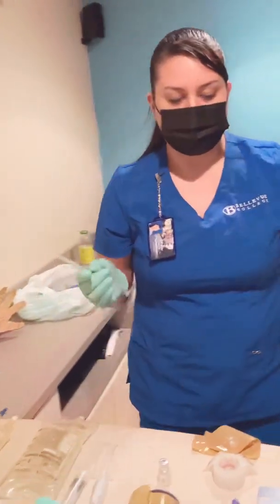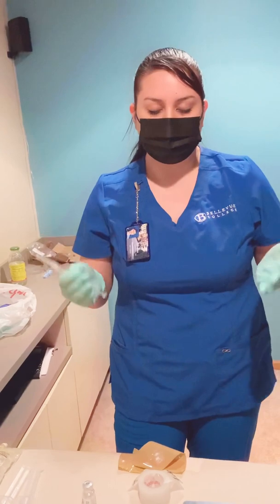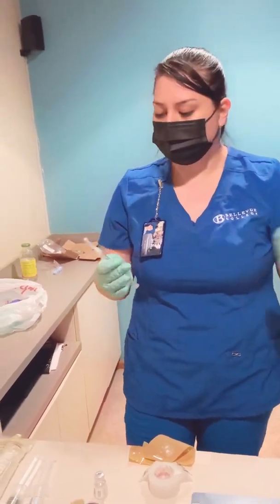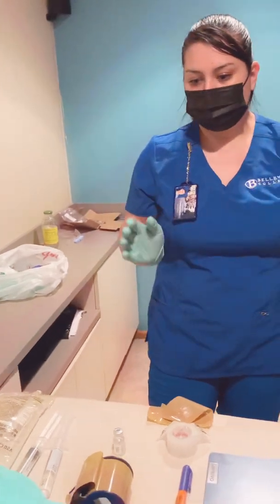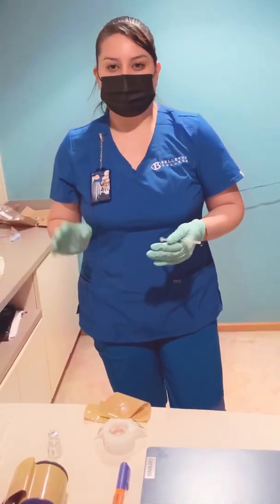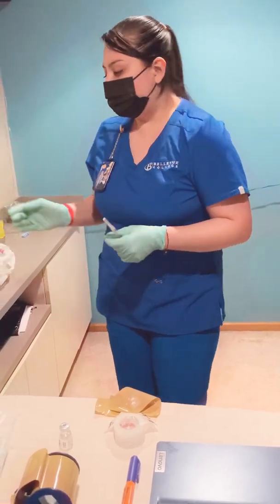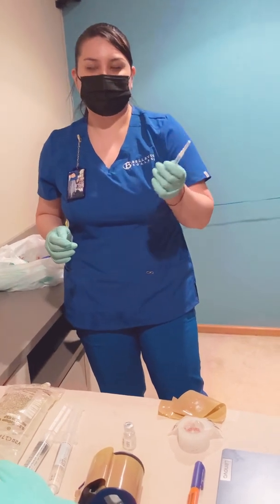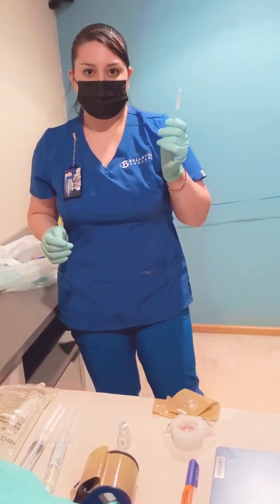But since I'm at bedside, normally you would have to label it in the medication room. So I have said the right patient, the right dose, the right route, the right time, and I documented. And I'm verifying at bedside that I'm giving 4 milligrams of ondansetron that is dispensed at 2 milligrams per milliliter.